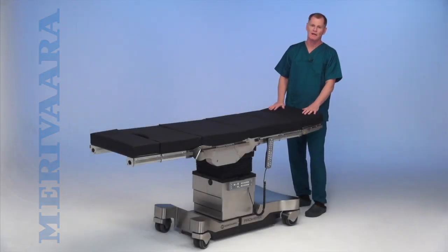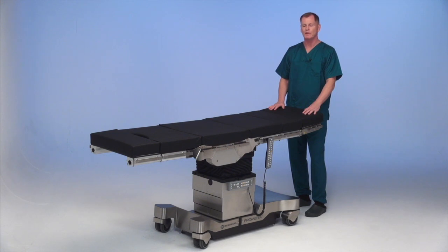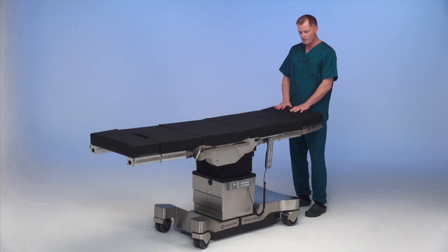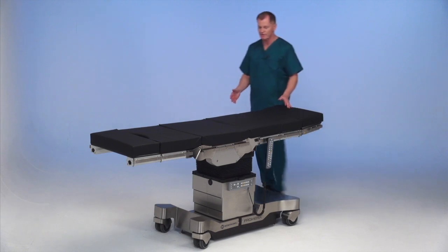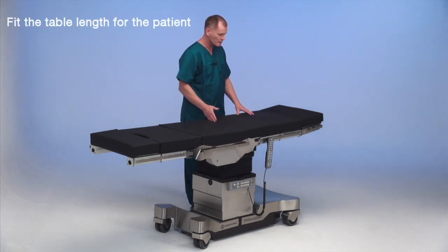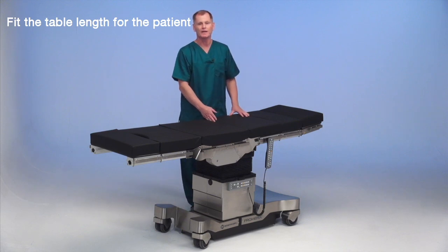Setting up the table for a patient in a lateral position for total hip or nephrectomy, which is removal of the kidney. First thing we're going to do is gauge the patient's length. In this case, we have a short female patient. We want to line her hip up right here for the kidney flex.